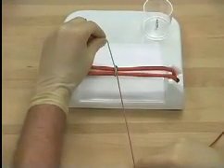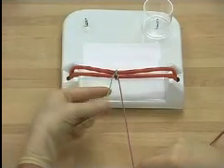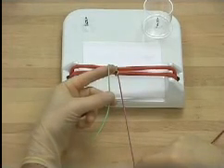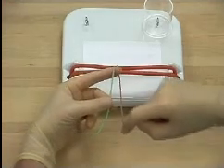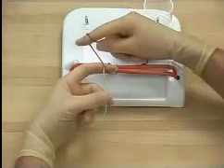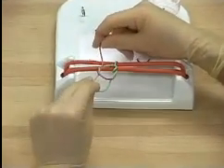On this occasion, the ligature is drawn away. The knot is then completed by placing the free end, holding it in the thumb and long finger, on top of the index finger, and repeating the first maneuver of the previous knot, using the nail of the index finger, to loop into the holding hand.